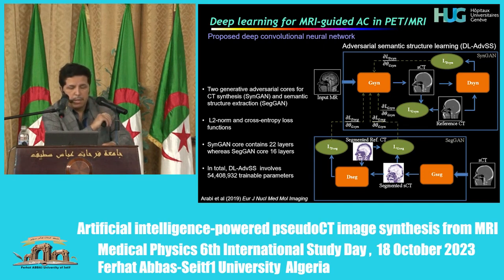We focus on the brain because it's simpler compared to the thorax and the other regions in the body. One compartment does the segmentation, and the second takes into account the synthesis. It's a very complex model. I'm not going to discuss it, just for the sake of time.